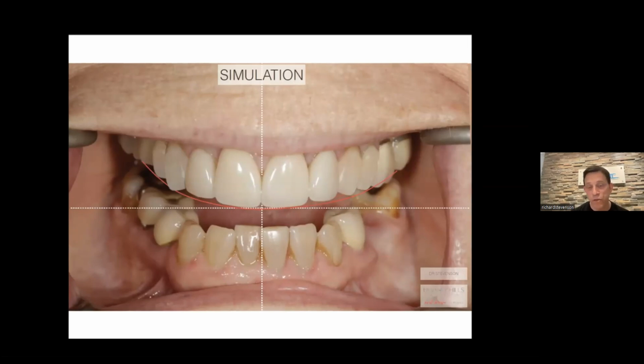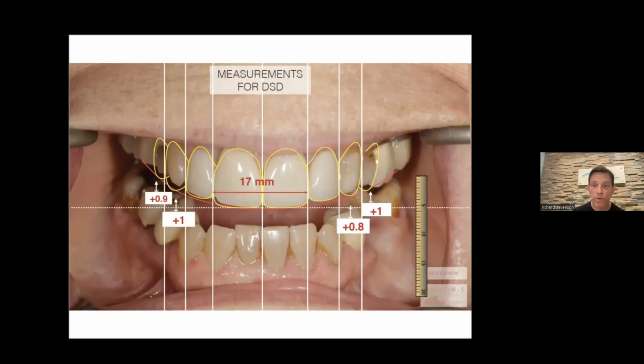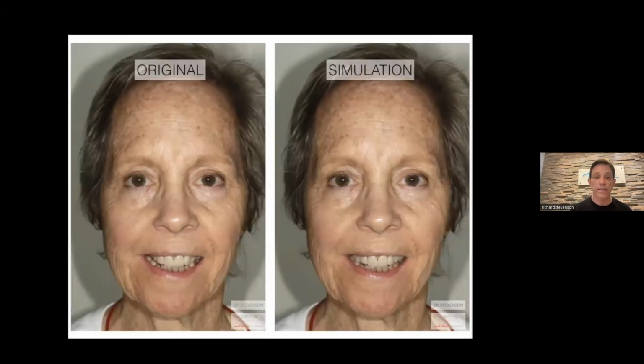And so when I showed this to her, she says, that's it. That's what I want. And so it was pretty easy, and the hard part was trying to keep these as veneers. And I promised her I would do it. So, when does a veneer become a full crown? As long as I'm bonding it and treating it like a veneer with light cured cement, and my preparation design is conservative, then I'm saying that's a veneer.